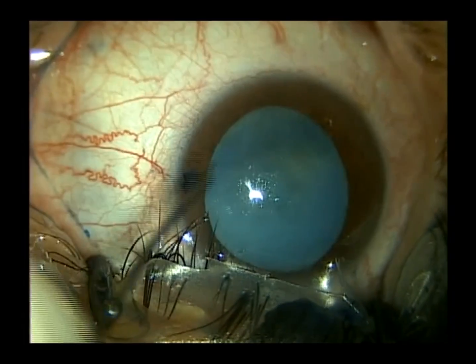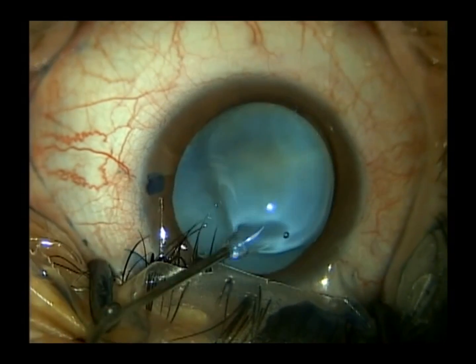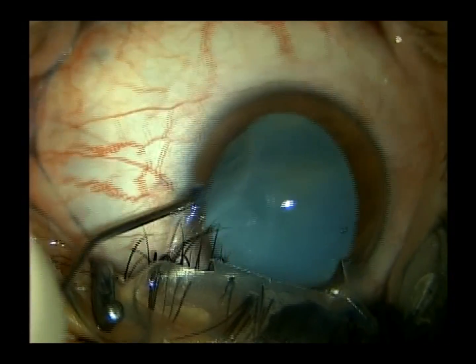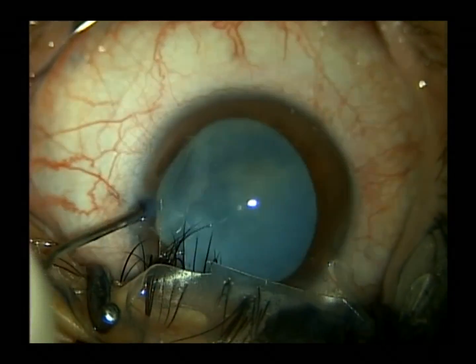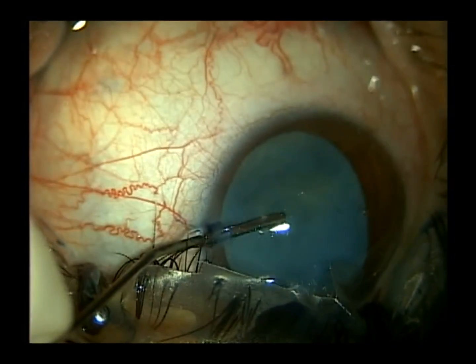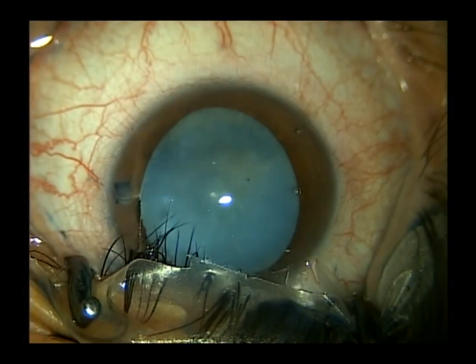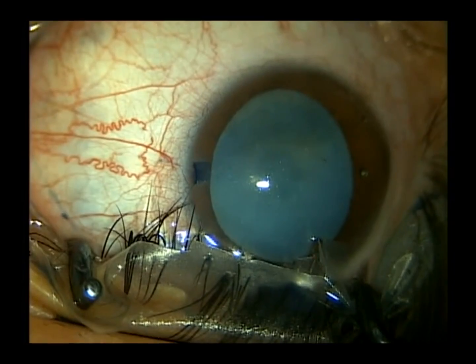We then fill the eye with OcuCoat, but prior to filling the eye, we get rid of any bubbles that may be at the tip of the syringe, and we apply the OcuCoat to the corneal endothelium to enhance visualization of the capsule inside the eye. Then we fill the eye with the OcuCoat and create our entry.